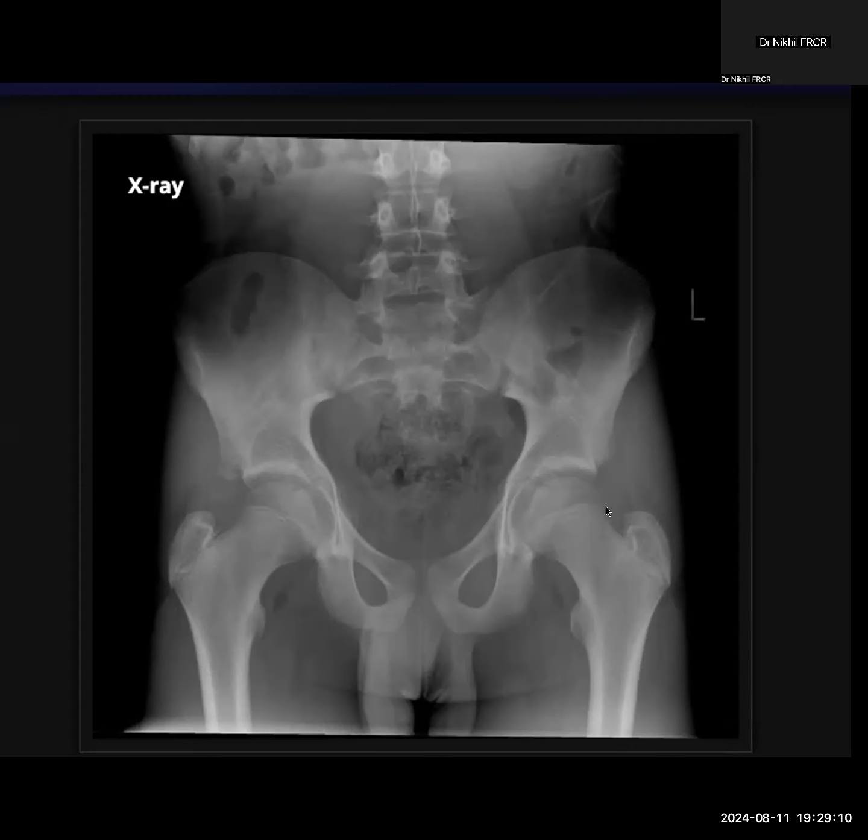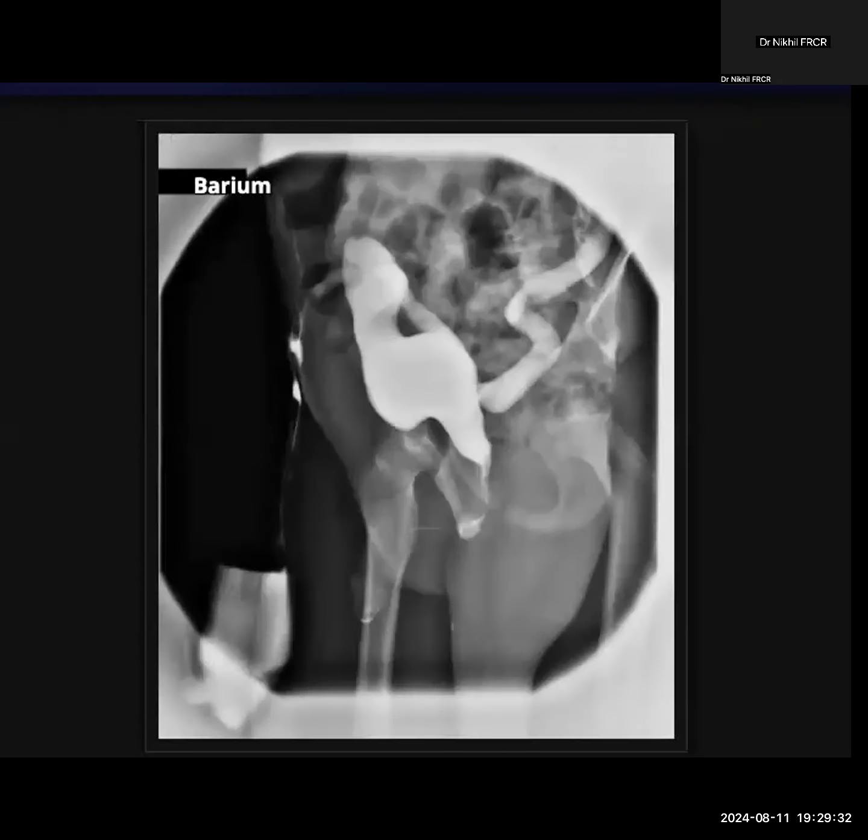Initially you were a bit confused about what muscle it was. If you were pretty confident, you could directly say that since this is the proximal attachment for rectus femoris, I would be concerned for a tear or an avulsion tear of the rectus femoris. That would come across as a better, confident answer. I wouldn't need to prompt you at that level. Otherwise, you did this case well.